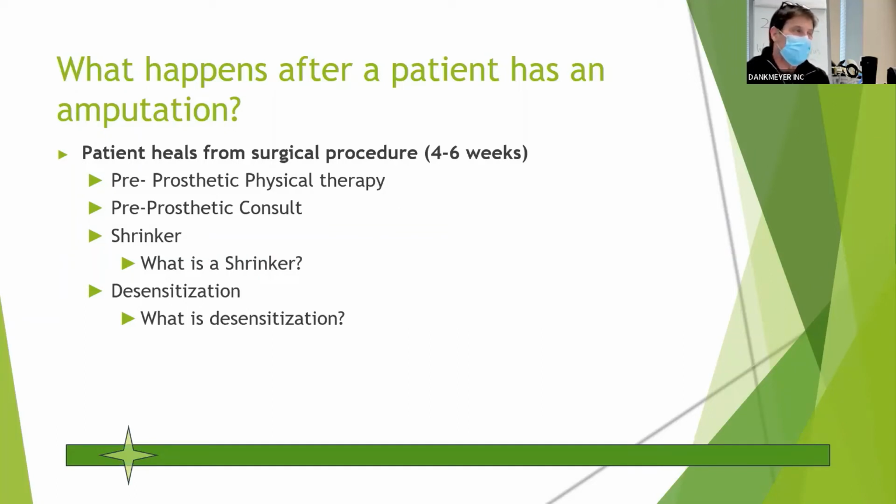And more importantly, if you're talking about high level function, the amputee mobility predictor has a ceiling effect and doesn't really sort out K4 very well. Most of us realize that function level 4 is really justified based on activities. So if you can document in your note or the physician's note and the prosthetist note that this child really is active, they run, they jump, they're not inactive, right?